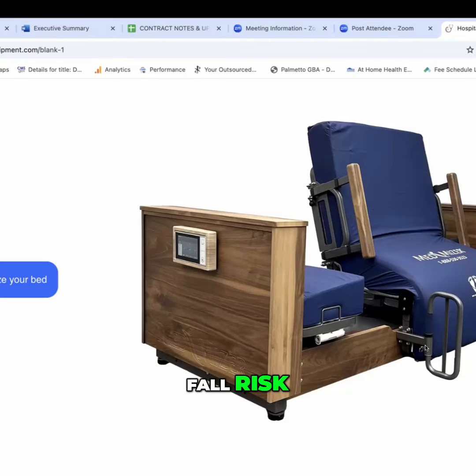If you have a fall risk, if the patient has rails on the bed, if they have sensitive skin, or they're trying to get out of the bed, do you need bumpers, do you need the full rails, do you need the half rails? All of these are questions that you should be asked, or to think about, when you're ordering a bed or getting one, because what you don't want to do is get a bed that has these fixed features when you could have got other additional features that now you can't add to them. Exactly. Now you spend all this money for a bed that may not work in the long run.